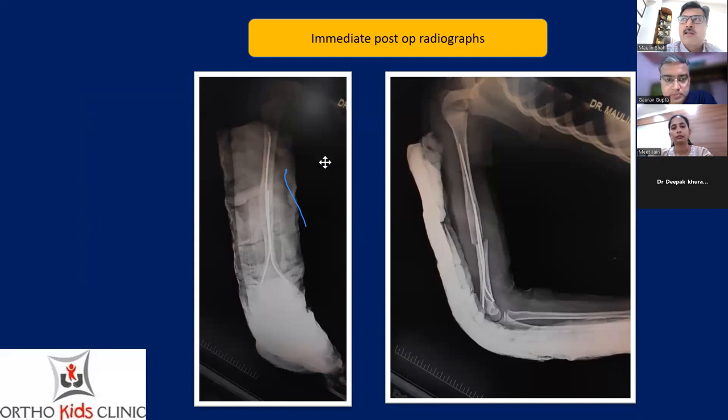See, the issue is the margin of the lesion is very sclerotic. When you reach that margin, you might have to hammer your nail. With TENS, the tip is curved and a bit pointed. With Enders, you may break the bone, I can tell you that. Whenever you are passing through the sclerotic margin of the lesion, you should have something to ream, and at the insertion site you can use a flexible reamer.